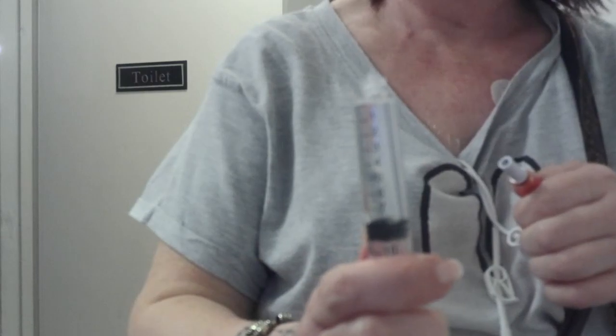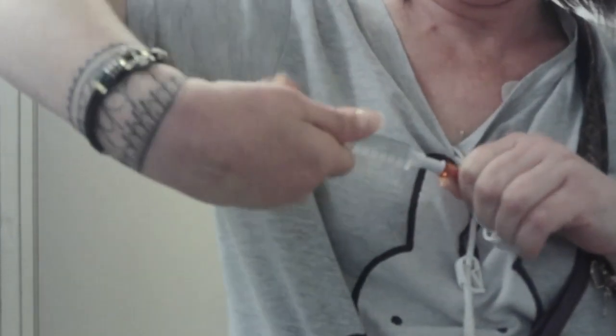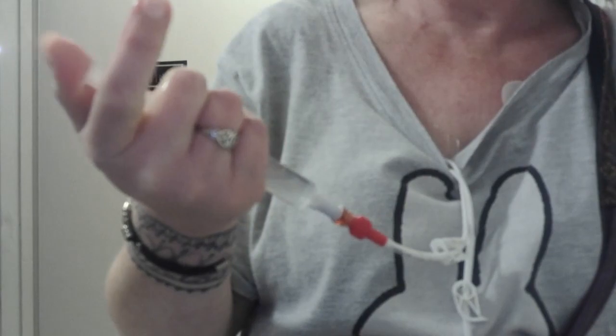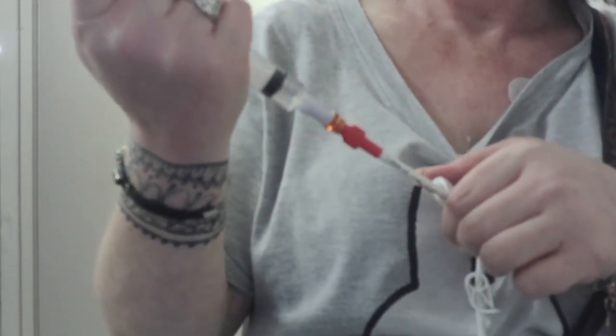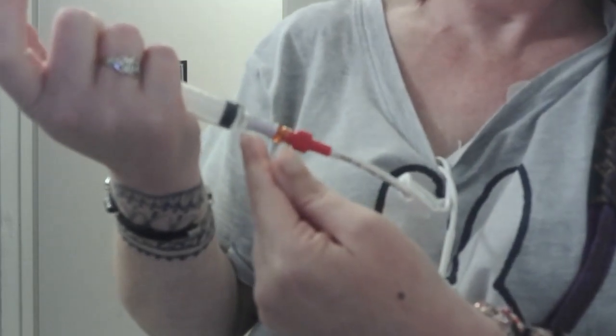And then this one, just make sure there's no air. Put that in. Unclamp. Flush that in. Push pulls. This is called push pulls. It breaks up any clots and keeps the line nice and patent. And before I've finished, I'll clamp.